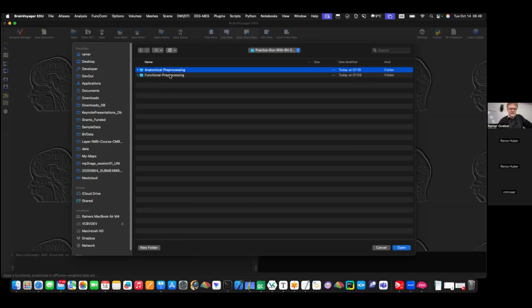So I missed one subfolder. This is just whatever you want. I named it myself, layer course or something. With respect to the data that you were sent this morning, this would be referring to the prepared anatomical. Exactly. You should unzip the prepared anatomical in your Nifti Anat folder. If you have downloaded the folder structure, then you should have a Nifti Anat with your NI files. Actually, we don't need them, because we opened the downloaded files. And we are one step ahead.